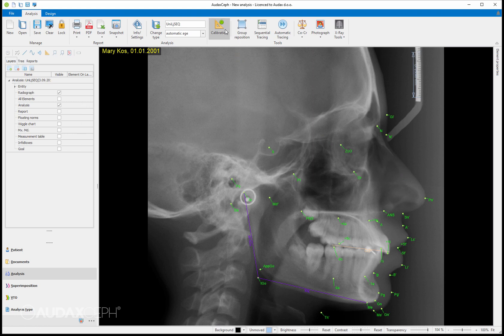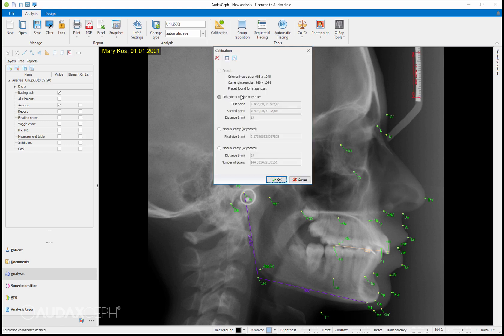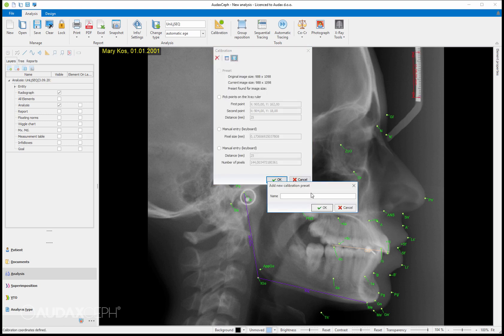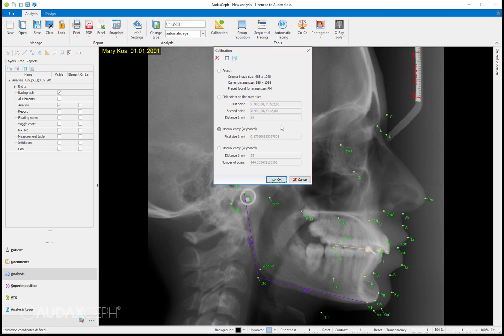Now you can see that this button is green so we can go on. I'll push this button again and I will save that into preset. So I will say for example machine name PM, for example for plant maker or something.